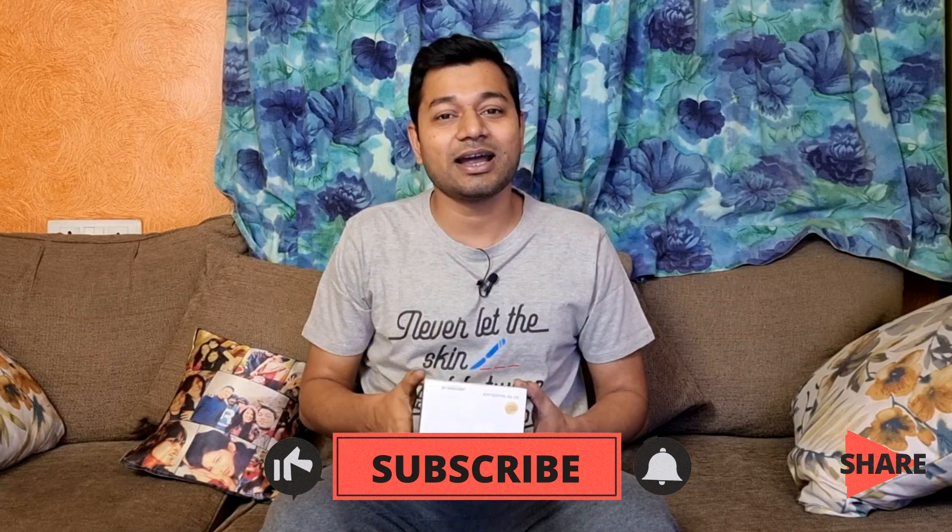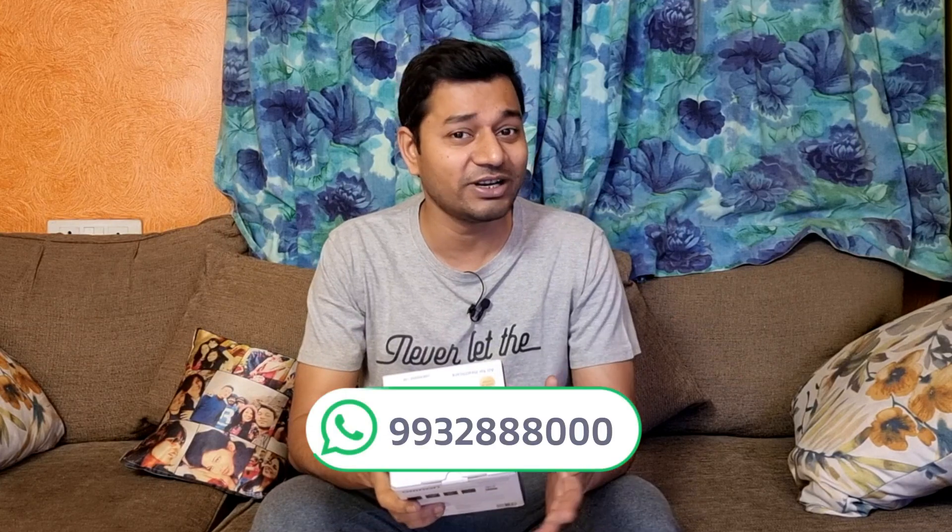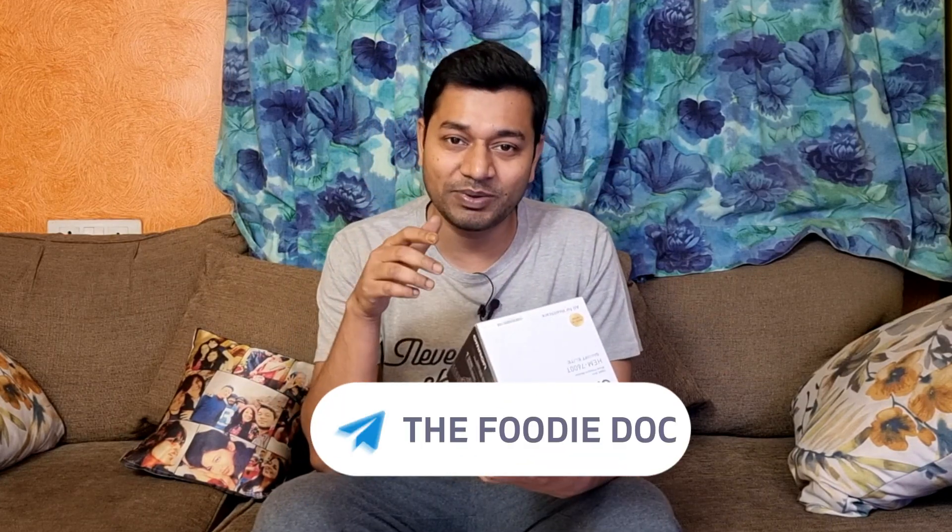I'm not going to show you the unboxing video. I'm going to show you the electronic and health-related. Basically, this is the electronic BP.